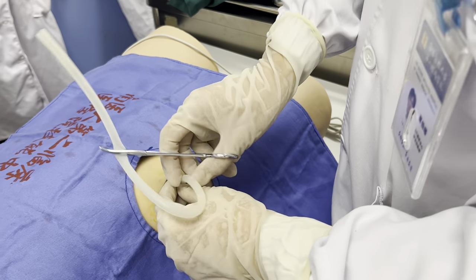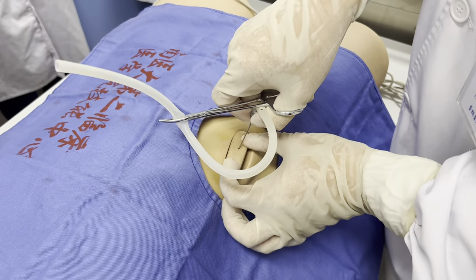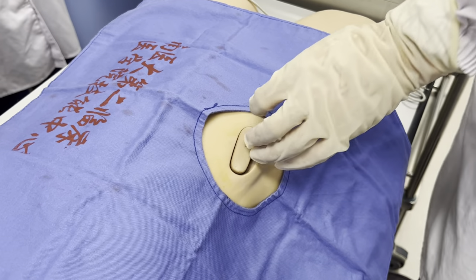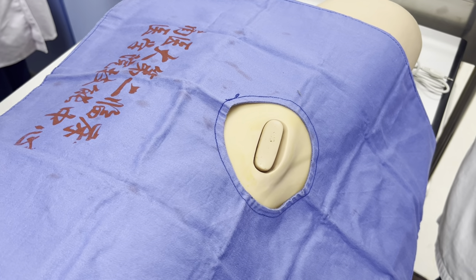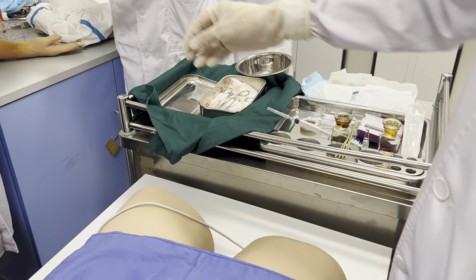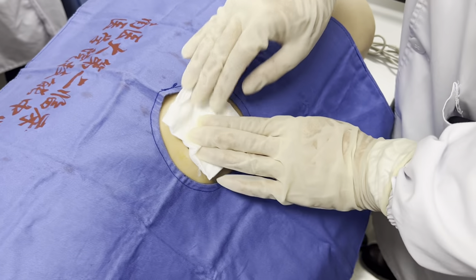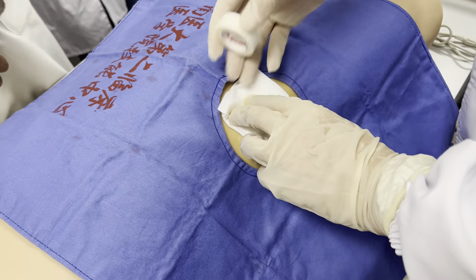After you have finished this procedure, you remove the needle and use a dressing. Of course, we should press it there. You need to use that, and also a sticker.